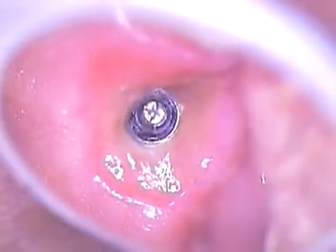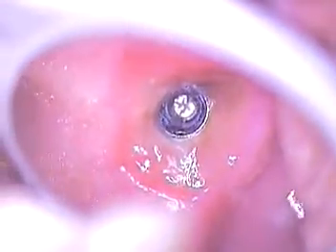Our first step was to find the history of what happened exactly, and then to look at what is involved. There was a prior attempt by the general dentist to remove the screws with the removal kit by Biomet 3i, unsuccessfully so. The dentist then went ahead and made access and got rid of most of the tissue that was covering the head of the implant.